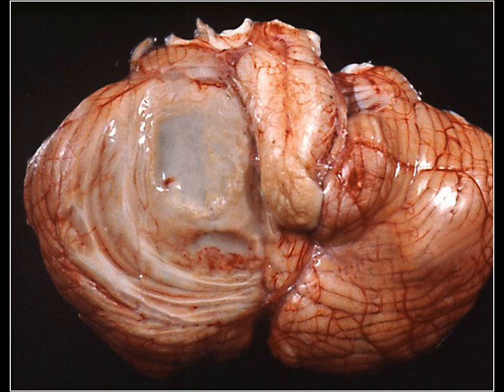On magnetic resonance imaging (MRI), the signal of the abscess center is between that of CSF (cerebrospinal fluid) and white matter on T1 weighted images, and isointense or slightly hyperintense to CSF on T2 weighted images. On T2 weighted images, the abscess rim is relatively hypointense. It may be slightly hyperintense to white matter on T1 weighted images. The pattern of rim enhancement is similar to that shown by CT.